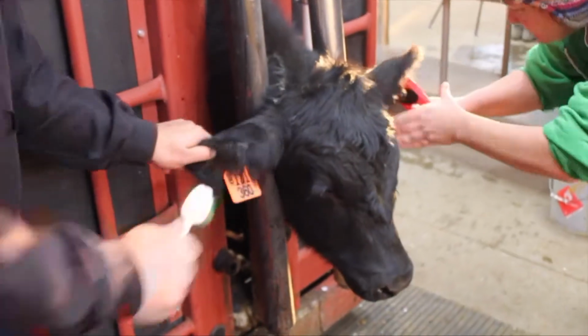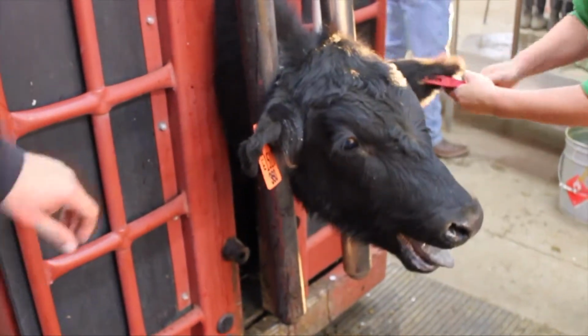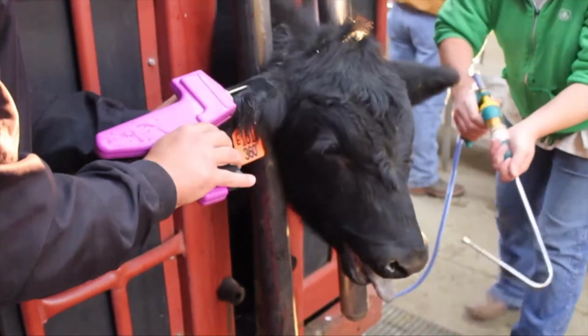So after we have them properly caught, what's the first step? Well, preparing the ear. Remember, we are placing these steroid implants underneath the skin. This is just like an injection that we would give in the side of the neck for beef quality assurance reasons, but these are placed on the flat of the ear, and it's a very big bore. So we want to protect that implant from any type of contamination. So we don't want to inject through manure, very dusty hide on the outside of the ear. So we may need to prep that ear and clean that ear before we administer the implant. This is where our disinfectant bucket, our scraper, our butter knife comes in handy.